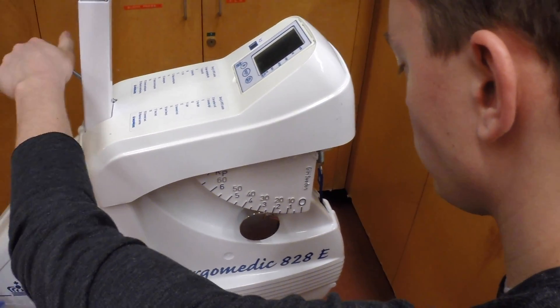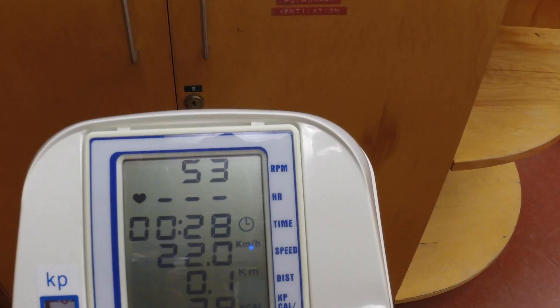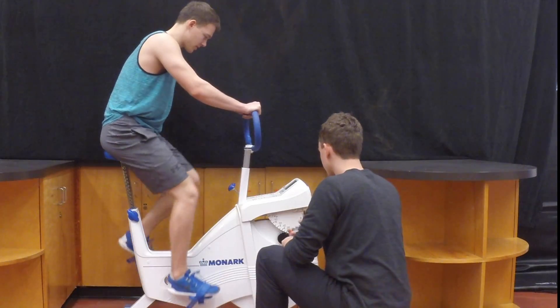The test is now started, so ask the client to pedal at a constant rate of 50 RPMs, and simultaneously start the timer.